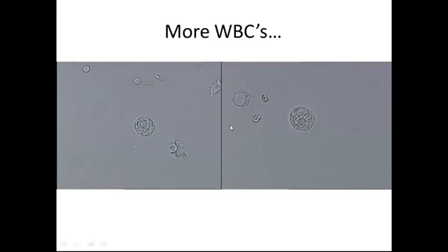So here are some more examples of white blood cells. So granulation, here are some with the nucleus that you can see. Note the size of the white blood cell and how big it is. White blood cells are many, many times bigger than your red blood cells. So this white blood cell is huge, and then here you have a red blood cell. So note the difference in size between the two. Also, the red blood cell, note the concaveness of it. White blood cells do not have that.